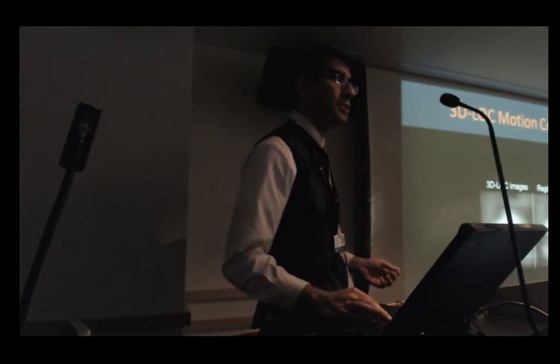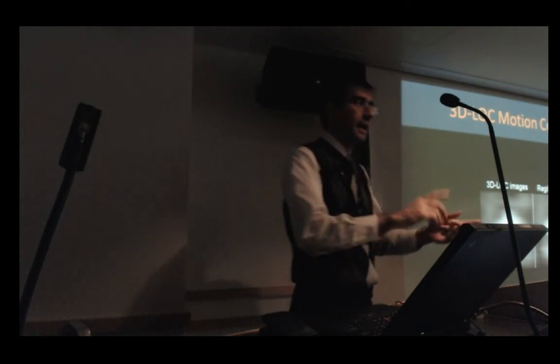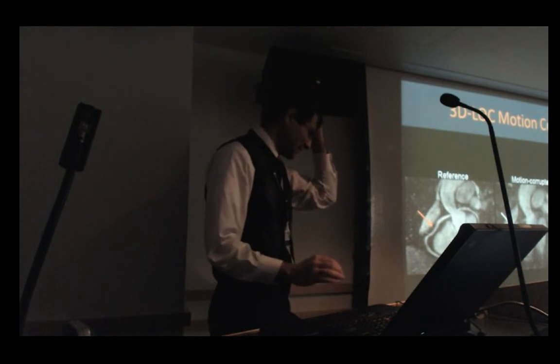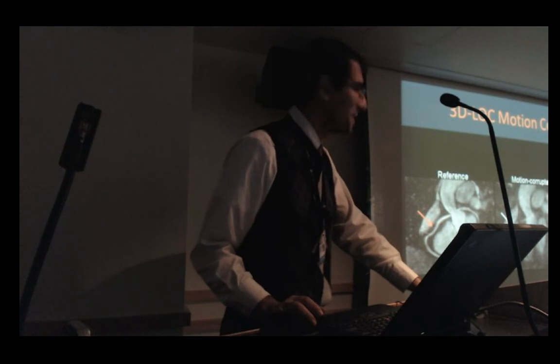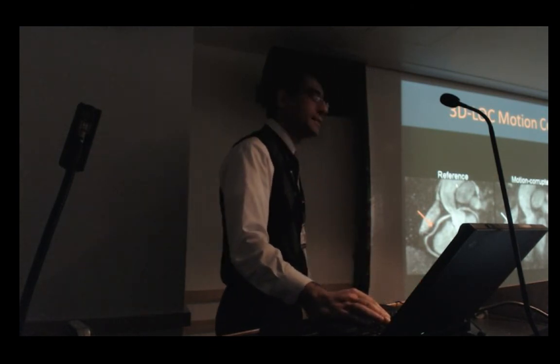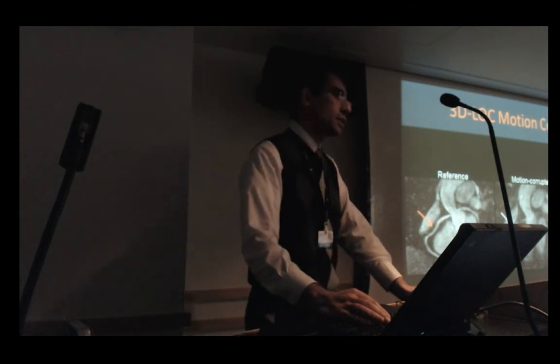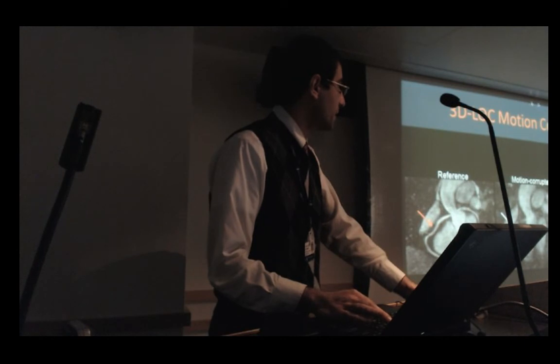This shows you the low-res image. You can appreciate the heart and the right hemidiaphragm. These are the images that we acquired at each cardiac cycle. So if I have 100 cardiac cycles, I'm going to have 100 low-res images. I can segment the heart from the liver and from the chest and back, because these are 3D images, and then register them together. This is the registered image after the correction of the motion along superior-inferior, AP, and right-left. And then I can correct for the respiratory motion in the acquired k-space data.